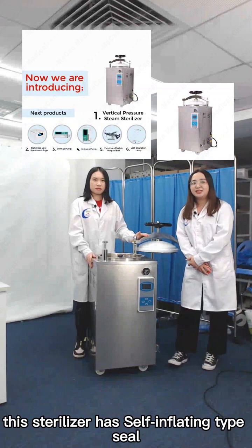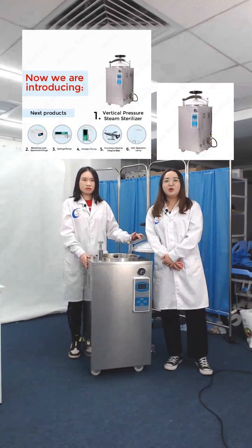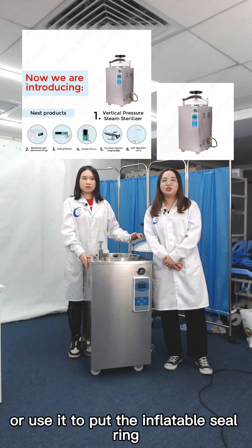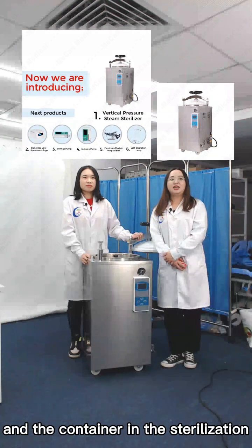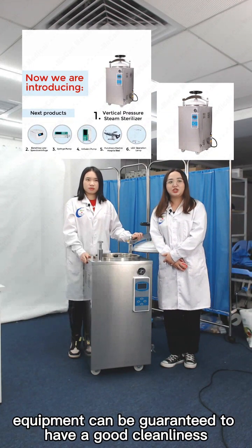This sterilizer has a self-inflating type seal. Most self-inflatable seals are closed at the end, which forms a hollow state. The purpose is to inflate the seal ring so that good air tightness can be ensured, and the container in the sterilization equipment can be guaranteed to have good cleanliness.